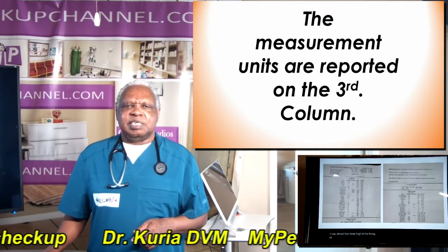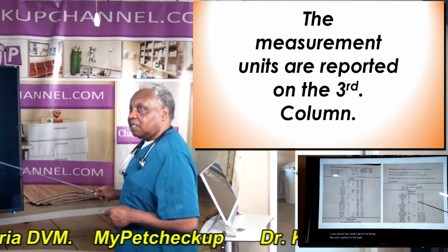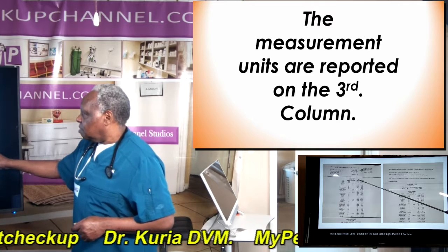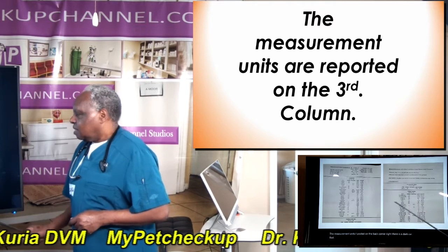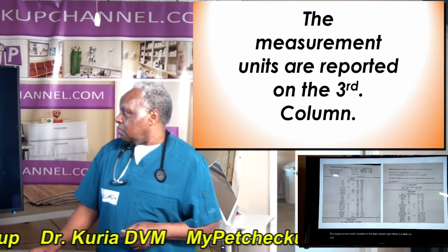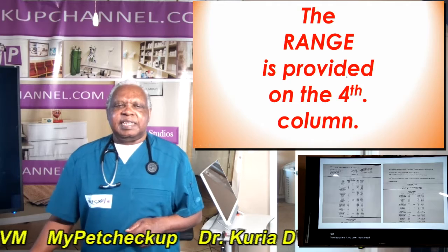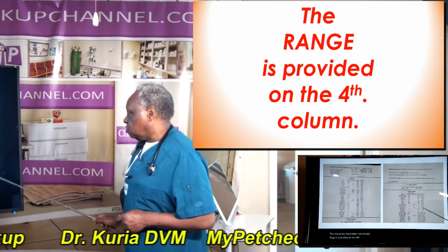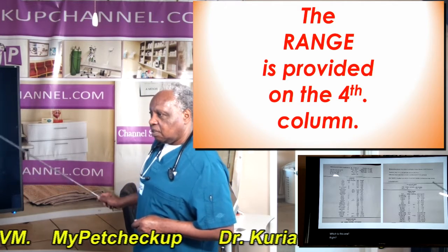The measurement units are reported in the third column. That's the measurement column. It shows the units with which the parameters have been measured. The range is provided in the fourth column, which is this one right here.